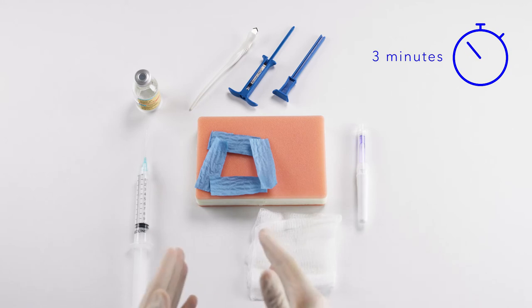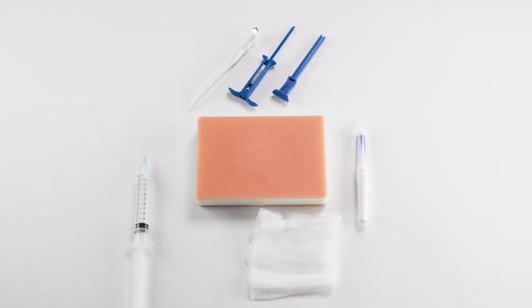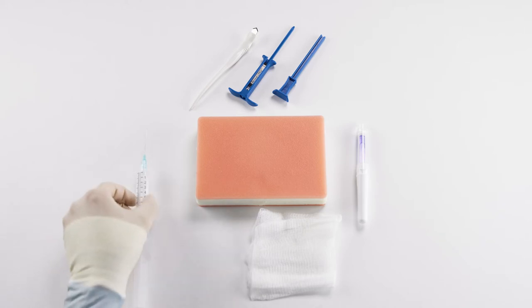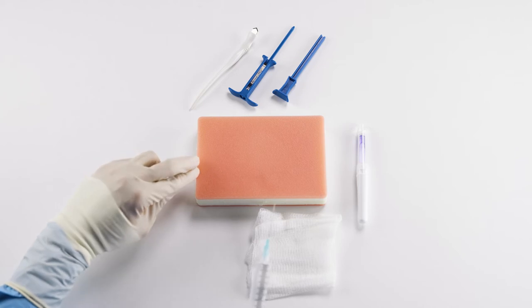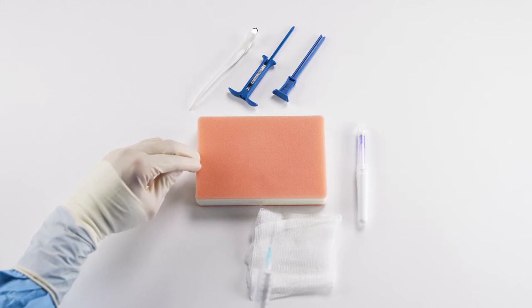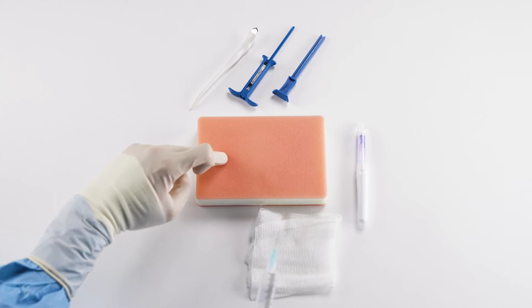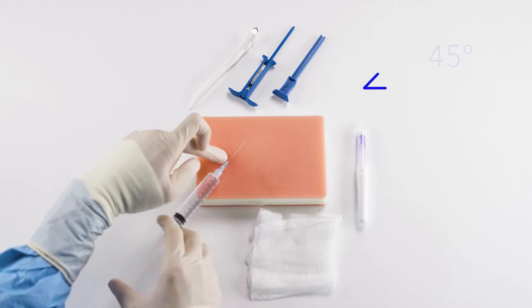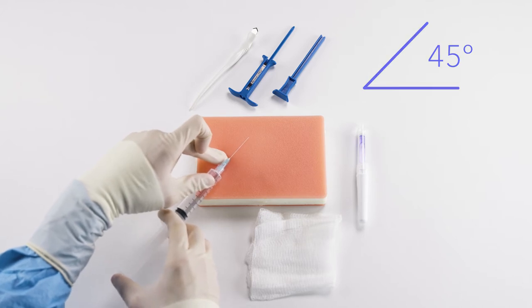For the demonstration, I'm going to remove these so you can better visualize the insertion technique later on. Now that the chloroprep has dried, we can begin. I'm going to grab my lidocaine with a 25-gauge needle and find the midline of my patient. I'm going to go 2 cm to the left at the left parasternal line and palpate down to the 4th intercostal space. Once there, I'm going to visualize a 45-degree angle, which is going to be my ideal insertion of the ICM.